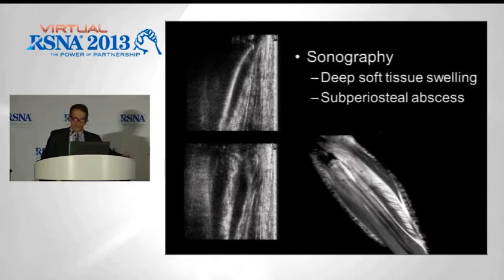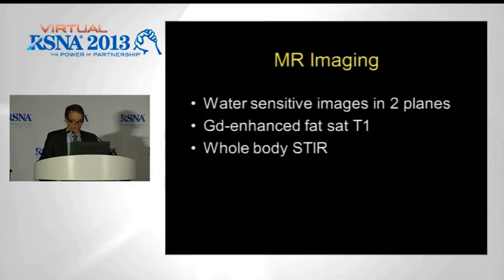Notice that I have not talked much about scintigraphy, and although scintigraphy has typically been the main diagnostic modality for osteomyelitis, I would contend that because of the prevalence of soft tissue abscesses and the importance of the detection of these soft tissue abscesses in therapy, modalities that can image the soft tissues are going to be much more useful than scintigraphy itself.